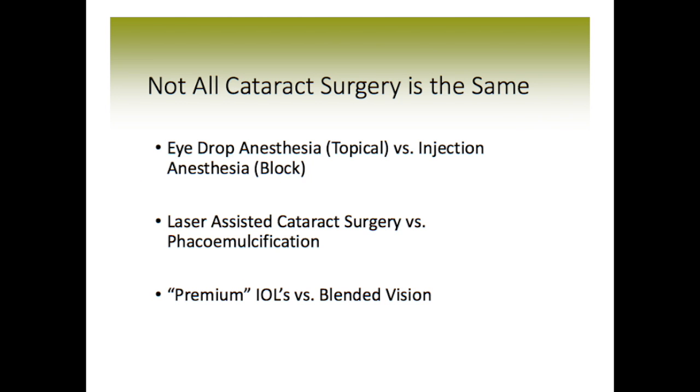Not all cataract surgery is the same. These days, surgeons use phacoemulsification to remove the cataract and replace it with a clear plastic lens called an intraocular lens. But there is a wide variety of techniques available that you should be aware of. Again, not all cataract surgery is the same.